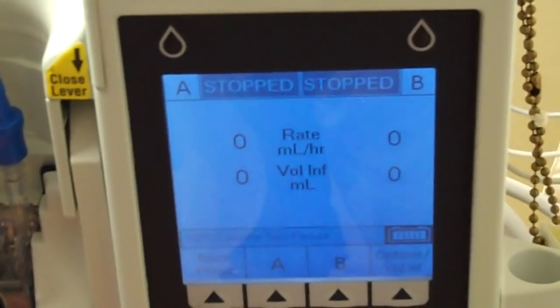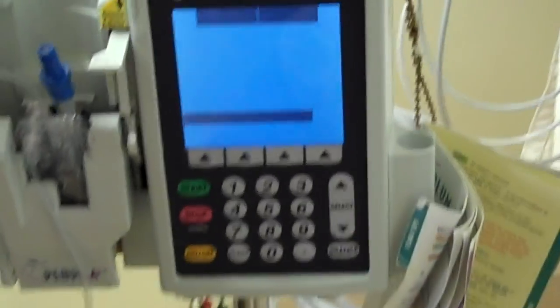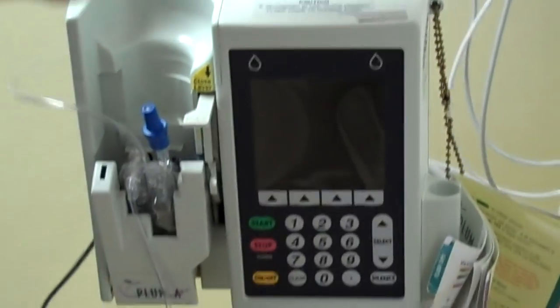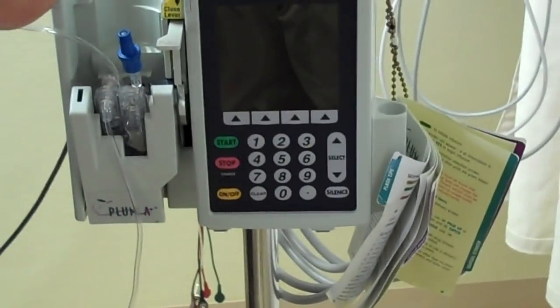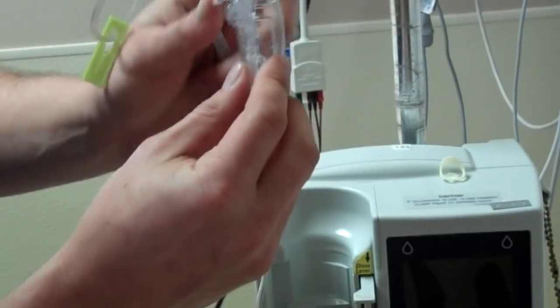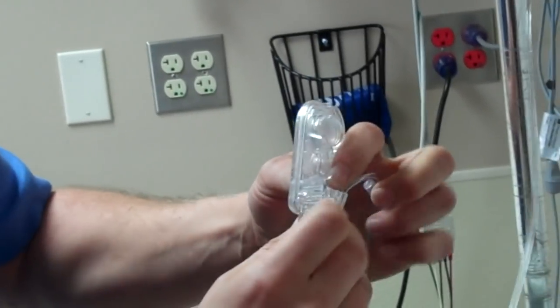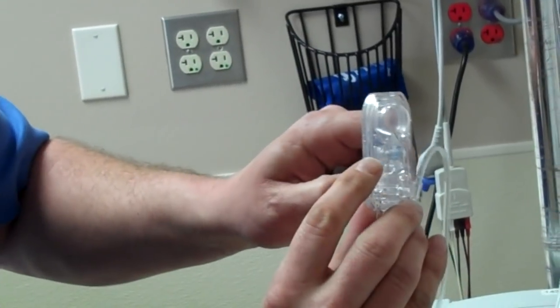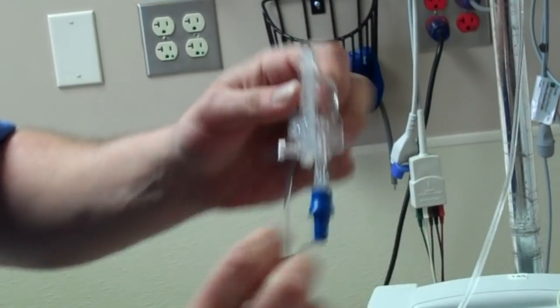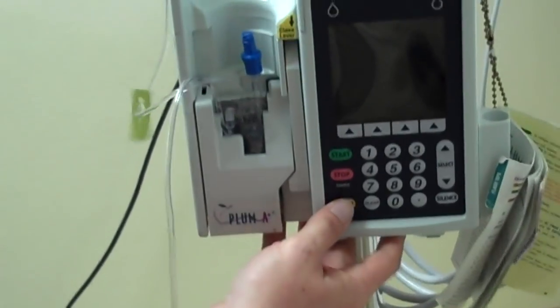We can hear the audible alarm, so we turn the unit off, open the door, spike the bag, and again we will take our cassette, turn it upside down, pull out the white knob until this chamber fills up, close the knob, place it into the pump, turn the pump on, and program it.